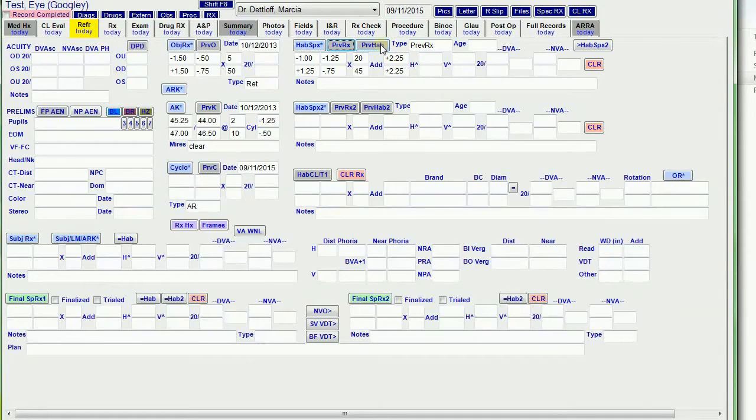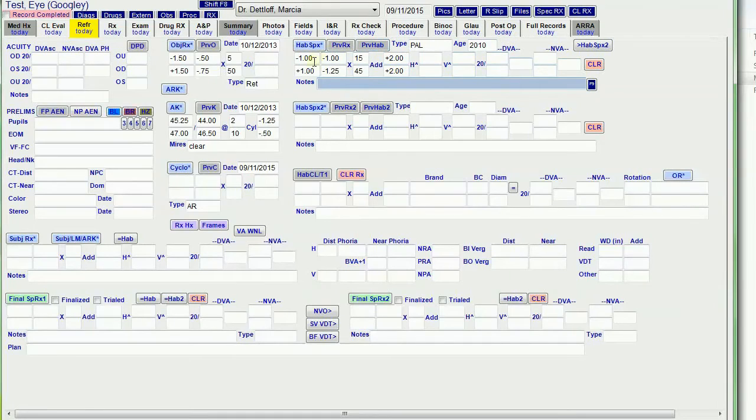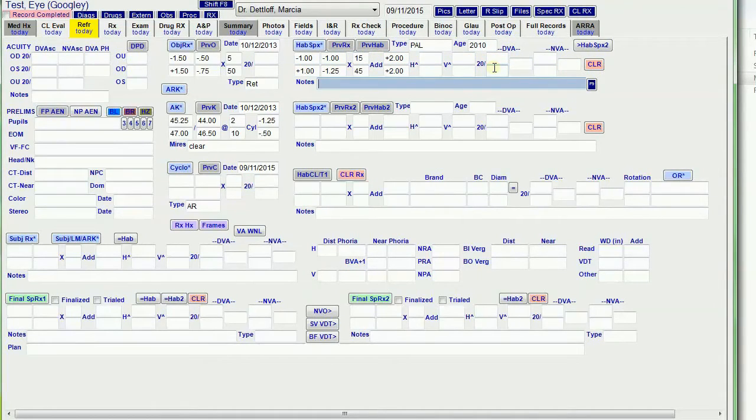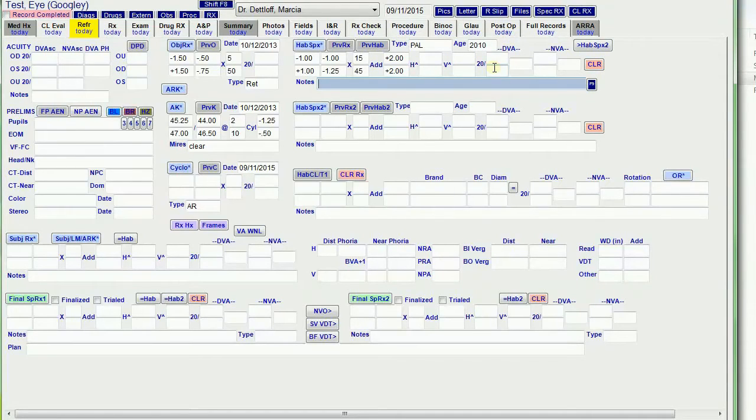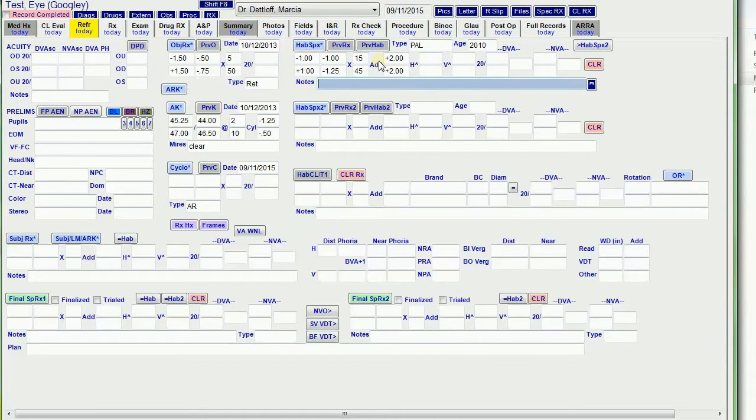And previous habitual brings forward the data that was in these fields at the last exam. So if they come in and they say I'm wearing the same glasses I had last time from four years ago, I use previous habitual, and it pulls that information forward.